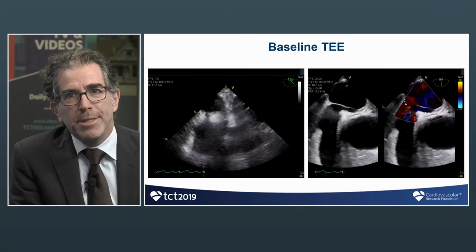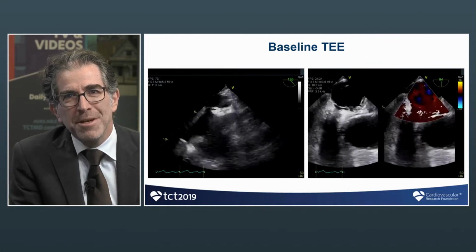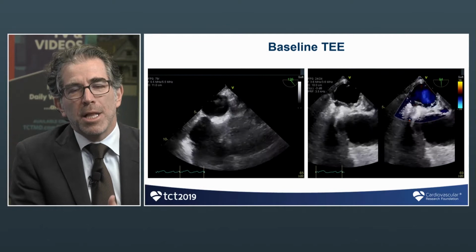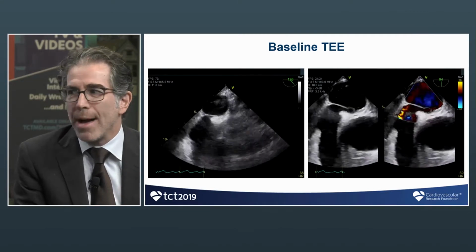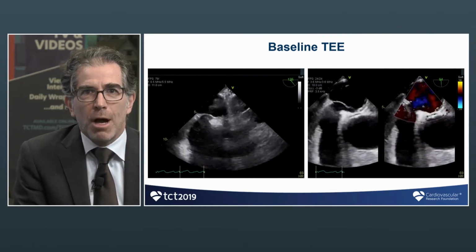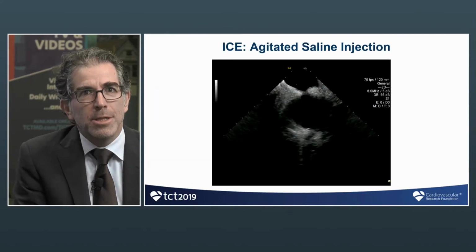And you do see that it appears to be a long tunnel, although you can sometimes be fooled. True. Because if we consider the right atrial side the entrance, and the left atrial side the exit, sometimes the exit is actually in the middle of what we think of as the tunnel or that flap, right? Right. And it does seem, hopefully, a little bit soft here as opposed to rigid, but we will find out. Right. So let's see what the next slide shows us here.